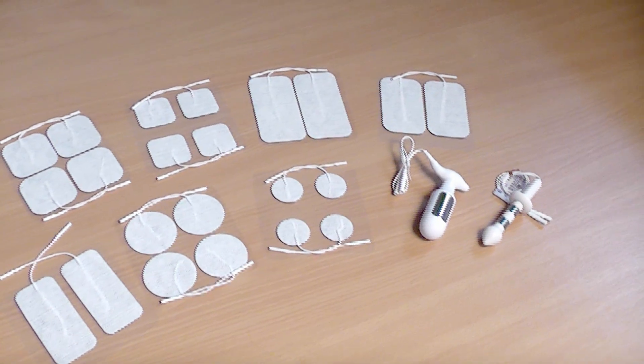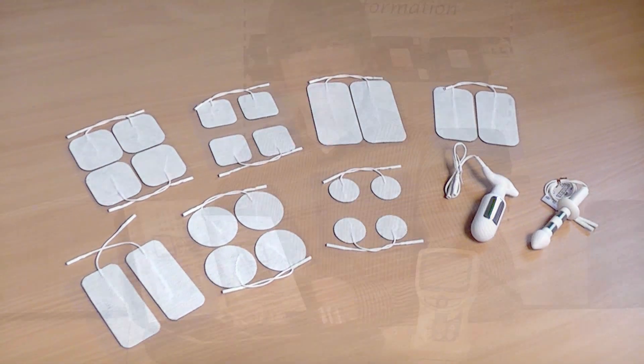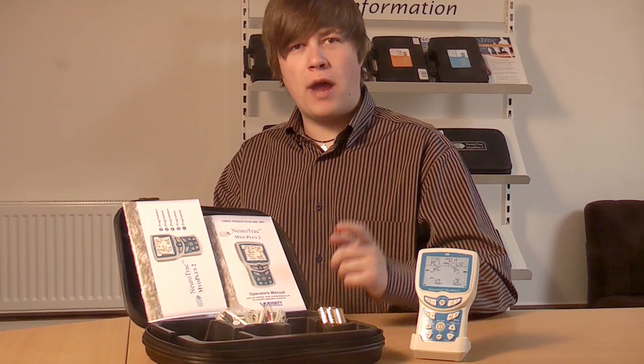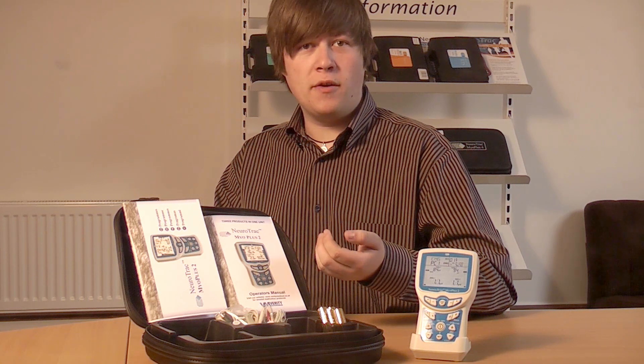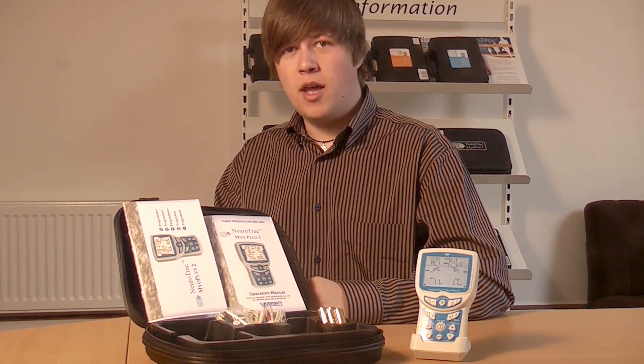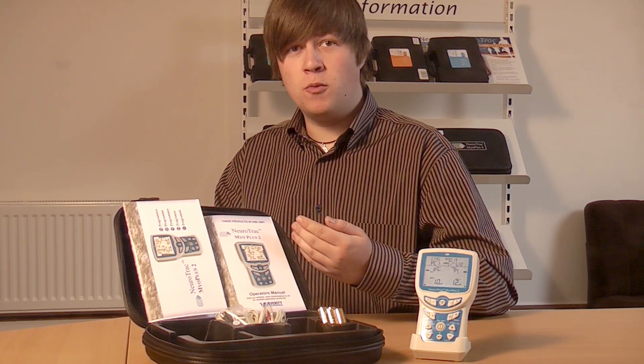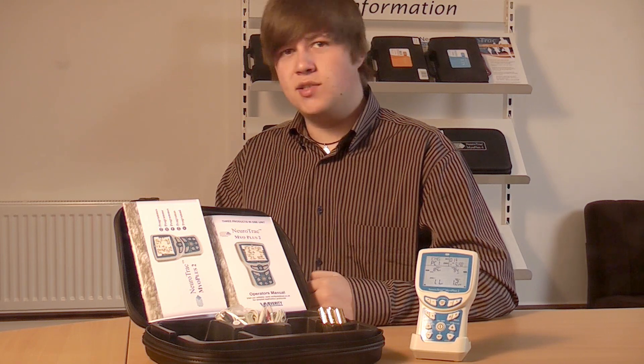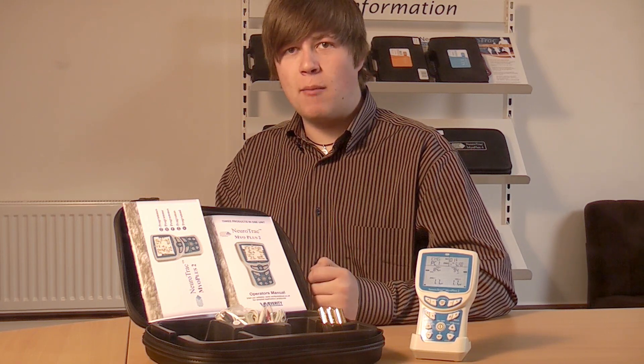Larger electrodes should be placed on bigger muscles. For incontinence, we recommend using the VeriProbe. In the manuals, you will find all the necessary information on how to work with your device. There are two manuals: one is for selecting your program, and the other, called the Operator's Manual, is for basic and advanced functionality. From this manual, you can find out how to do things like lock the device, so that the patient cannot change the program when working at home or in a clinic.